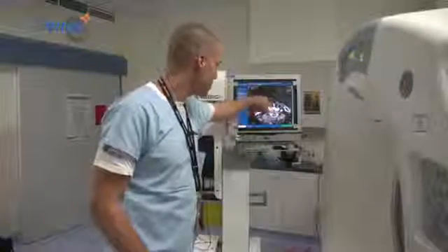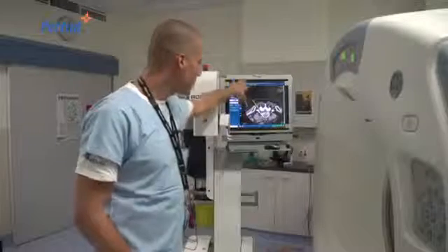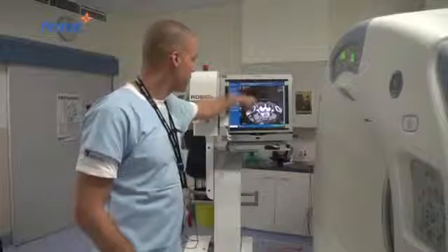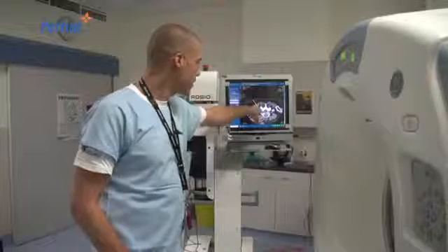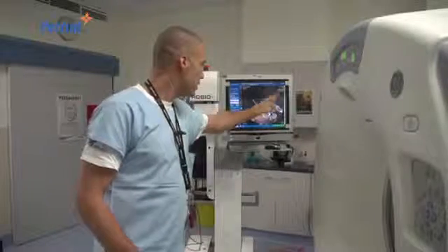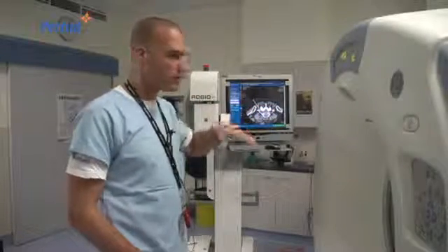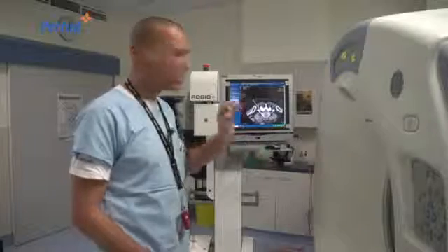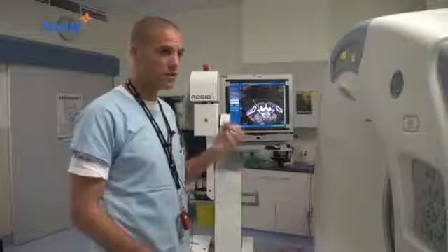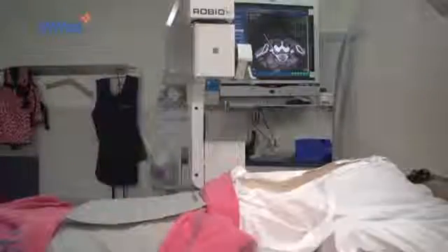So having it actually guide us at least to the very target point in this patient was very handy, because you've got perfect angle, you know where you're going to anesthetize, and we had a guide. In this patient, she actually moved very slightly so that we ended up very near that lip, but it was easy to make that adjustment because we already had our perfect angle, so we could just come back, slide in, and I actually do the depth perfectly because the holder was there. So that was actually a good case for me to get used to it.